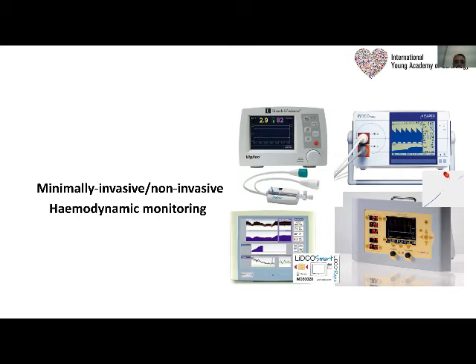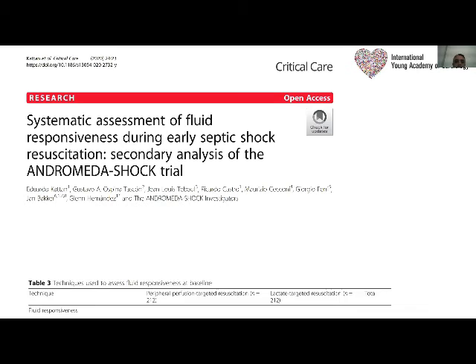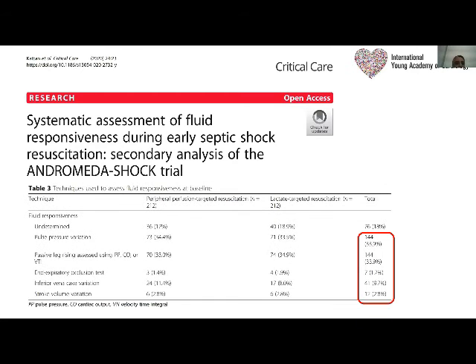Minimally invasive monitoring was a very interesting topic from Dr. Susanna Price, about minimally and non-invasive hemodynamics. I will just mention one slide, a secondary analysis of the ANDROMEDA-SHOCK trial, 2020. In this secondary analysis, they found that you may know the fluid responsiveness of about 80% of the patients from the minimally or non-invasive parameters.